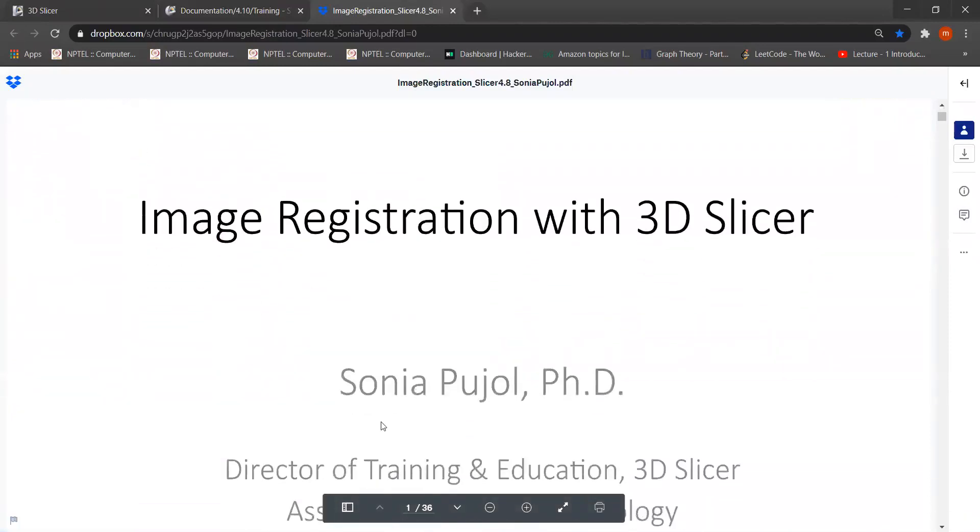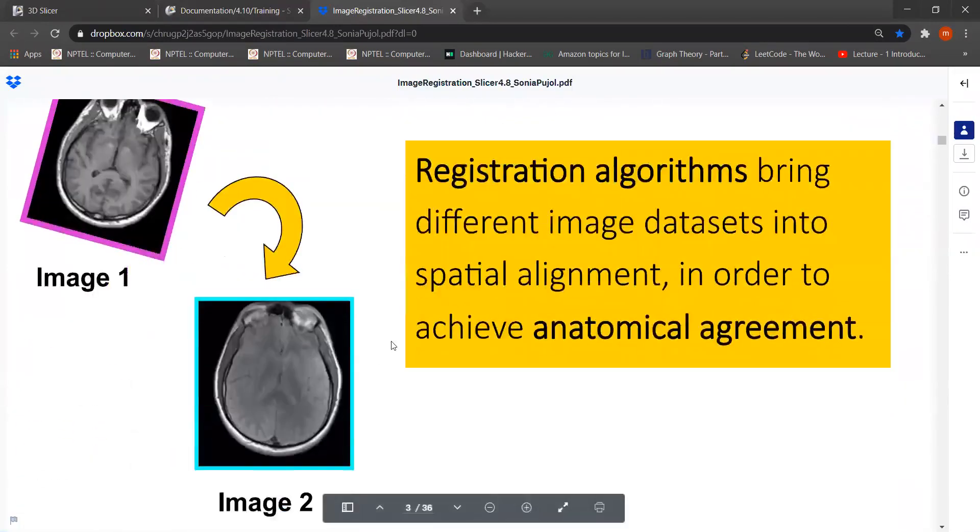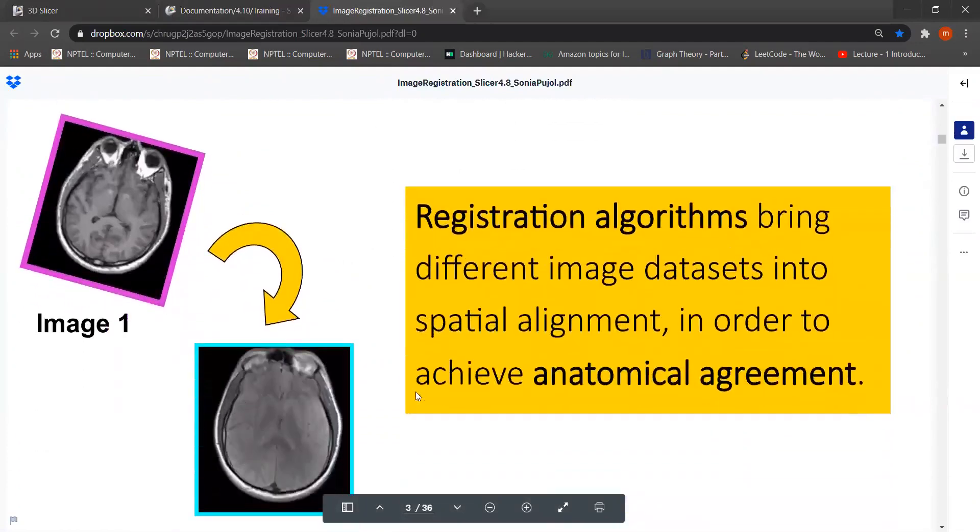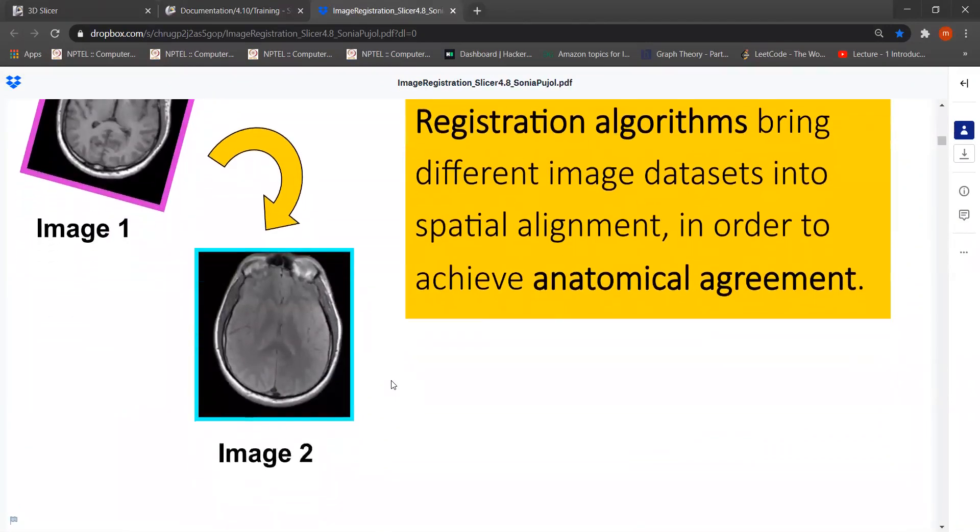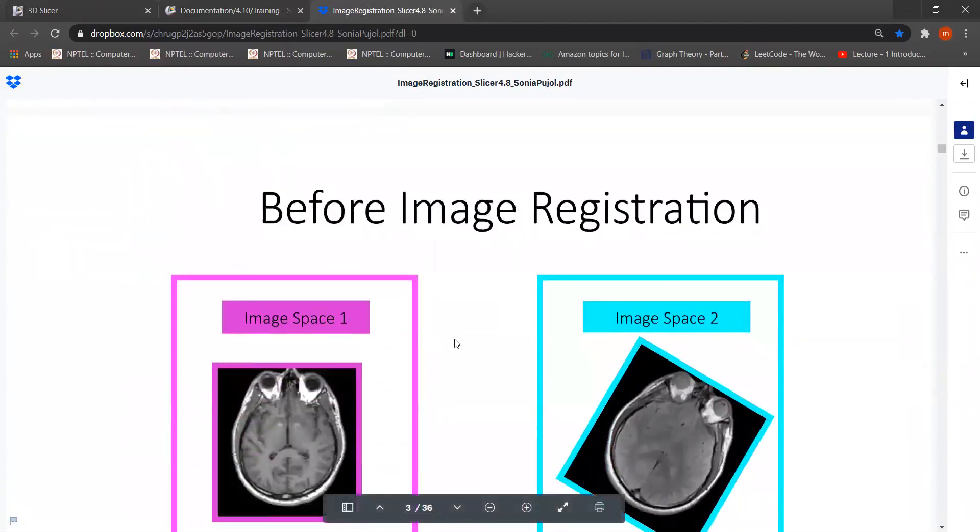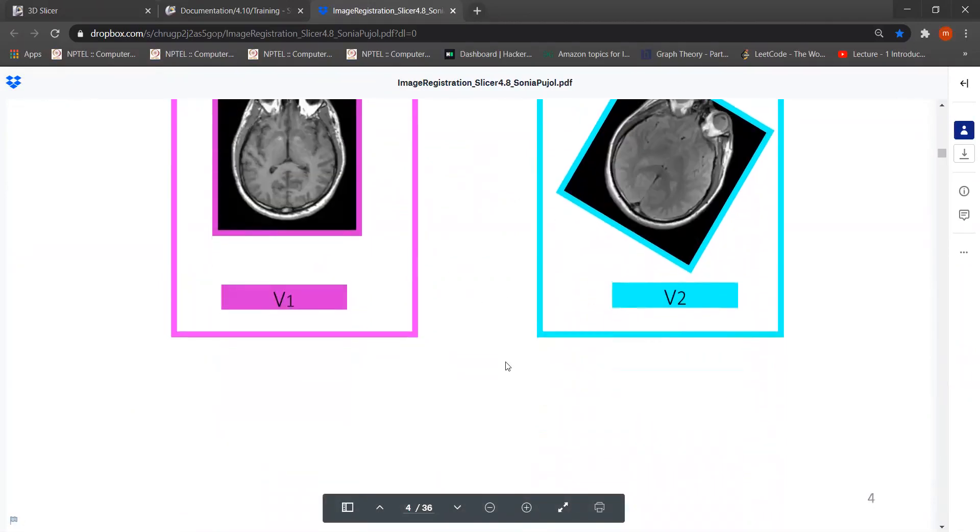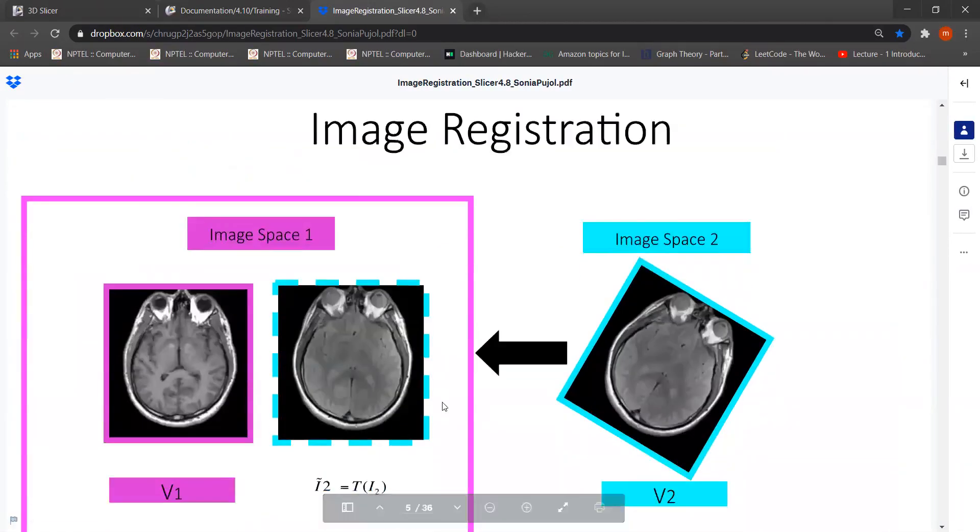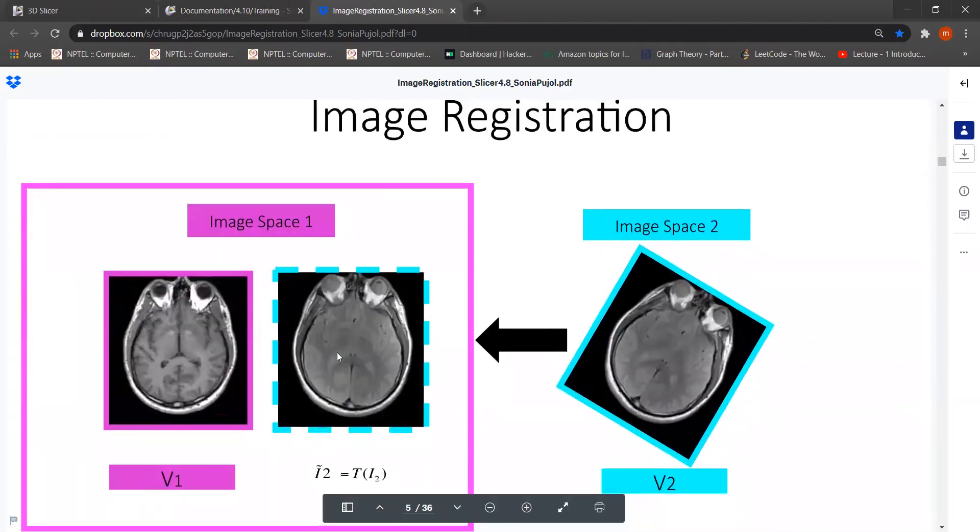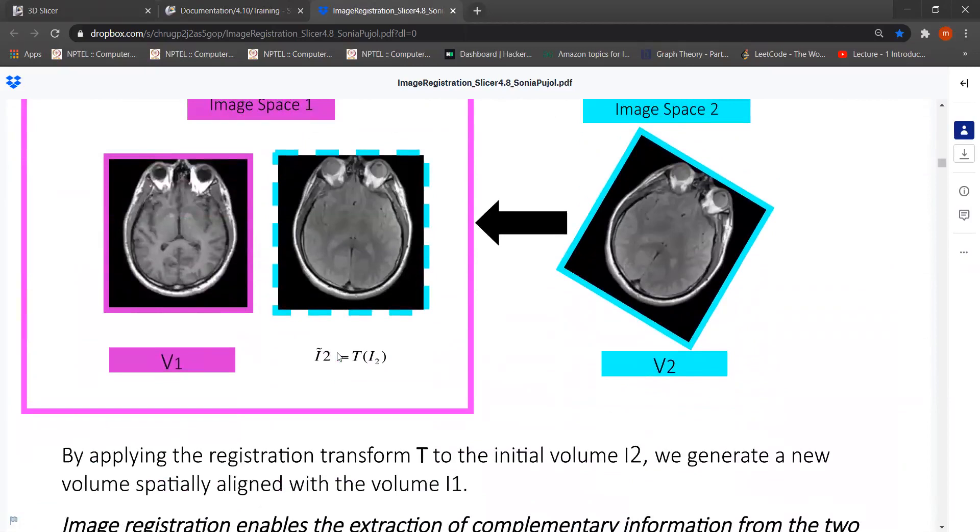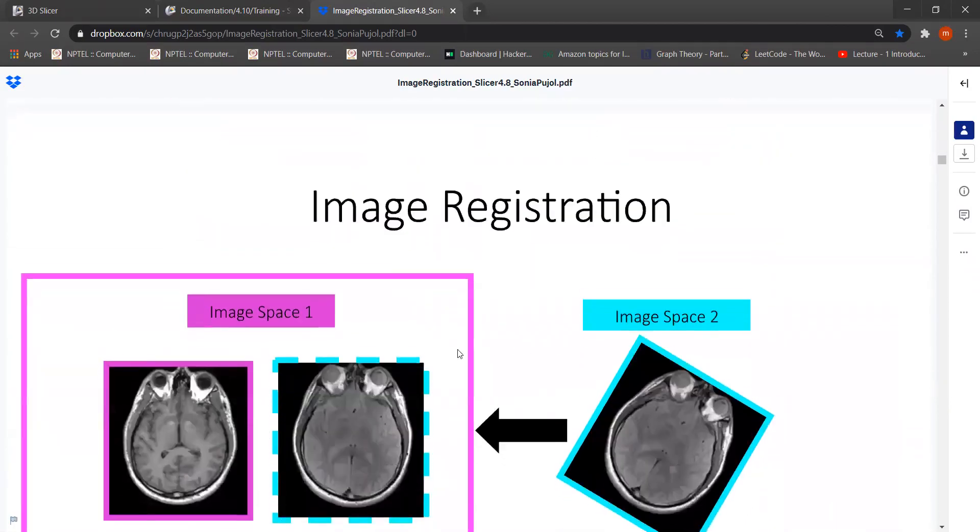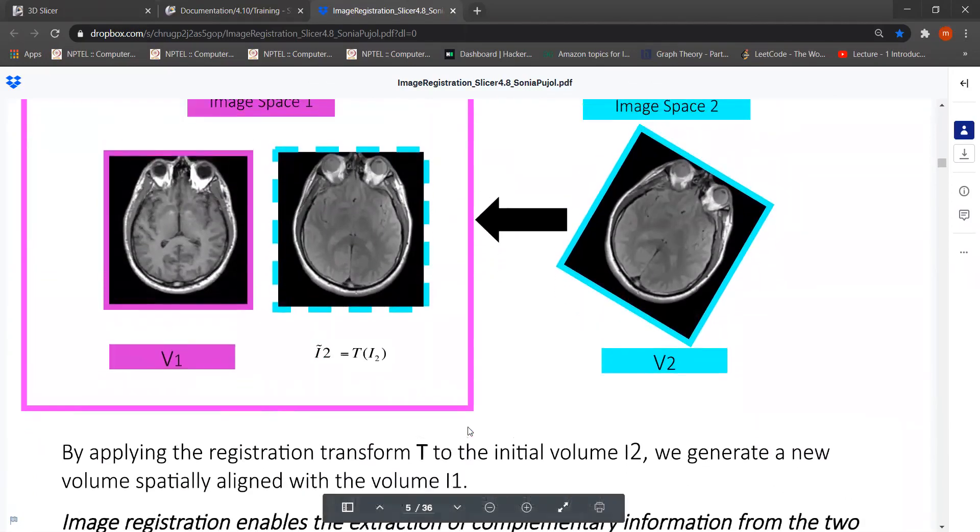Registration is one method from there we bring different image database into one alignment. Firstly, we can see before image registration two data is like that, and after image registration we can see. So basically by image registration we transform one image to other for the same alignment of the image.